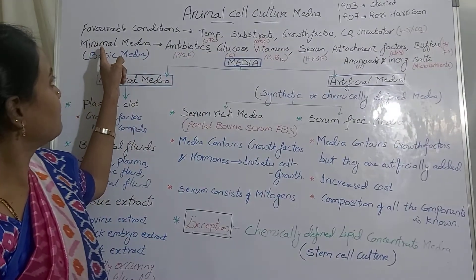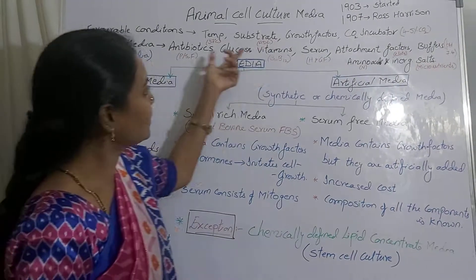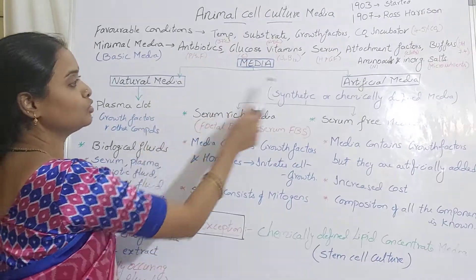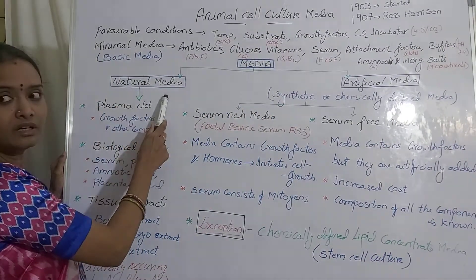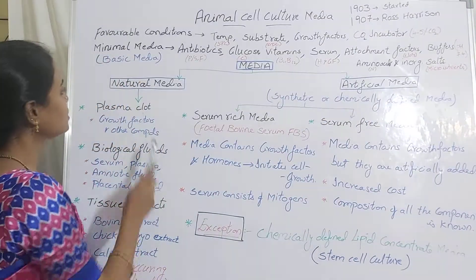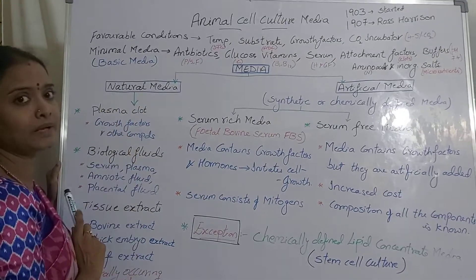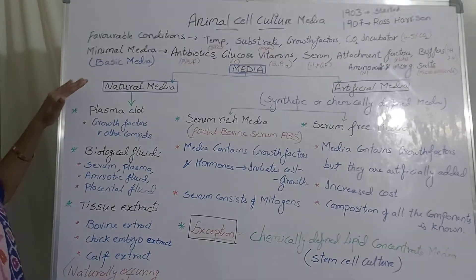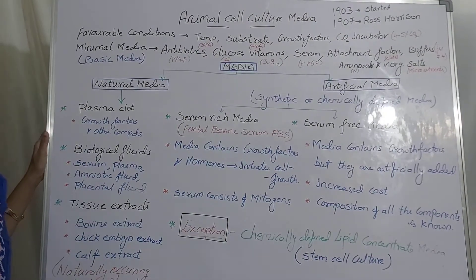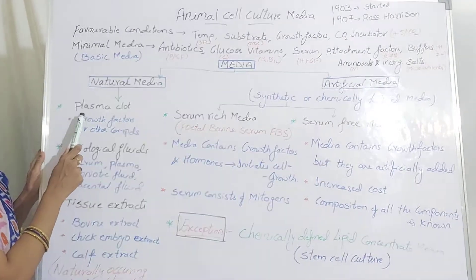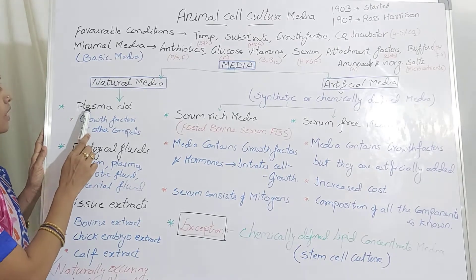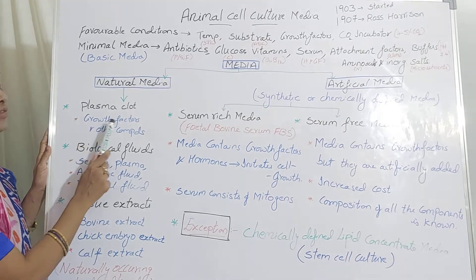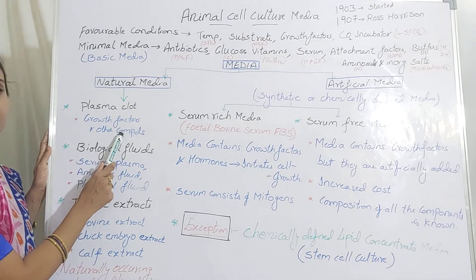These are the basic nutrients, which is why we call it minimal or basic medium — any type of cell can be grown in it. The media is classified into two types: natural media and artificial media. Natural media, as the name implies, is obtained from naturally occurring body fluids. Any type of naturally occurring body fluid can be used as media. The first type is plasma clot — blood is simply allowed to clot and the plasma clot is used as media, providing growth factors and all components required for animal cell growth.